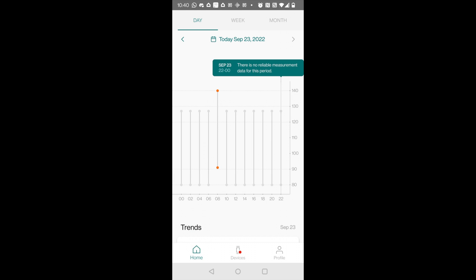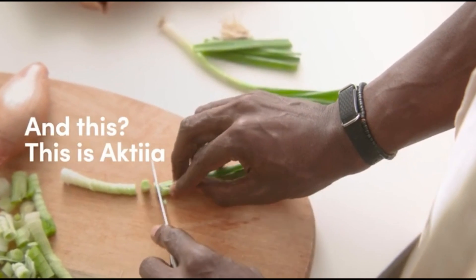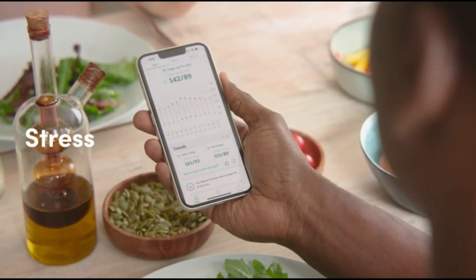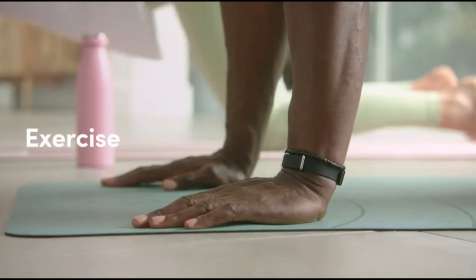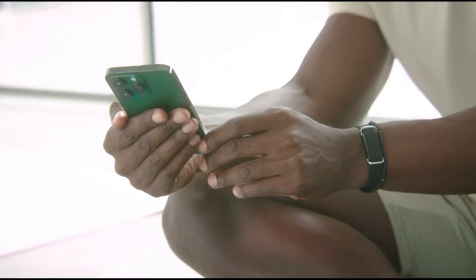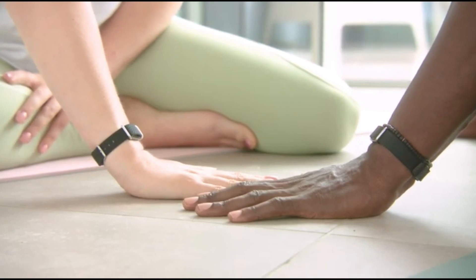One thing I noticed about the app is that you only get blood pressure readings at two-hour intervals. I think the two-hour interval is just too large — I would have preferred a 15-minute interval recording of my blood pressure at least.